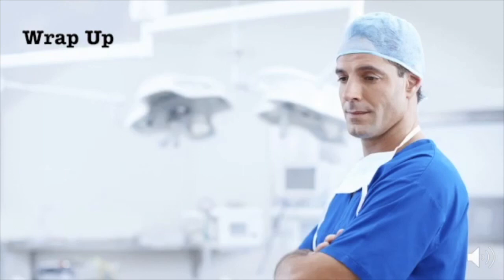Here's a brief review. One, when you first arrive on the scene, make sure you listen for the hum, check the batteries and the connections, and read the alarm code. Remember to bring the batteries and charger with you to the hospital. Two, vitals are important, but keep in mind that the best method available to measure the blood pressure on an LVAD patient is the automatic cuff, and it's only accurate about 50% of the time. Remember to use your clinical judgment to assess perfusion.